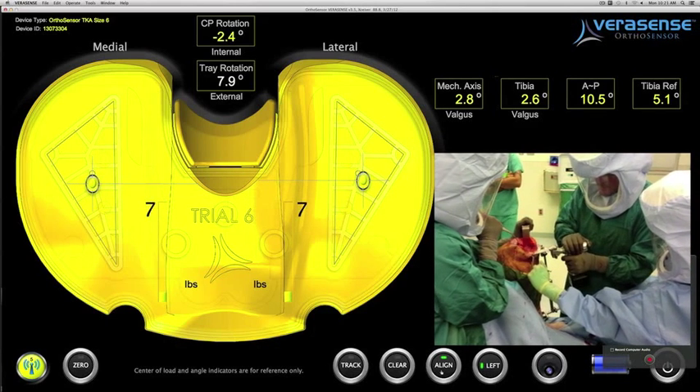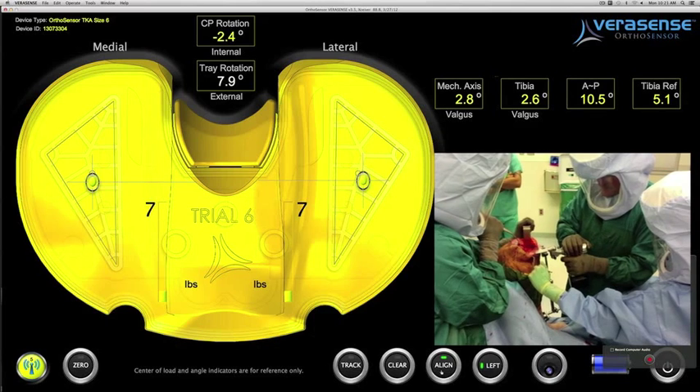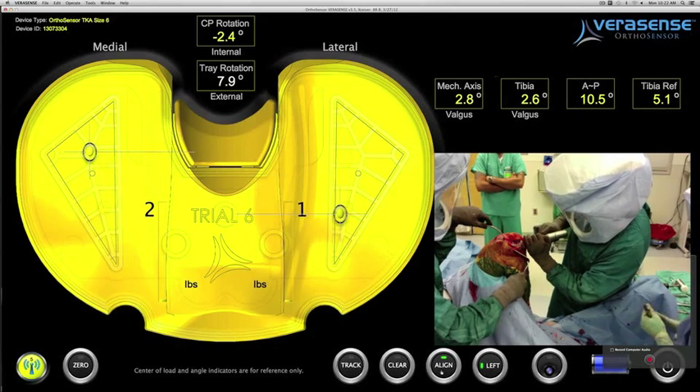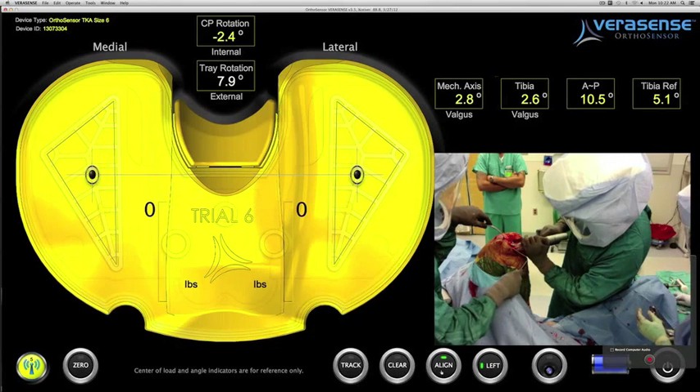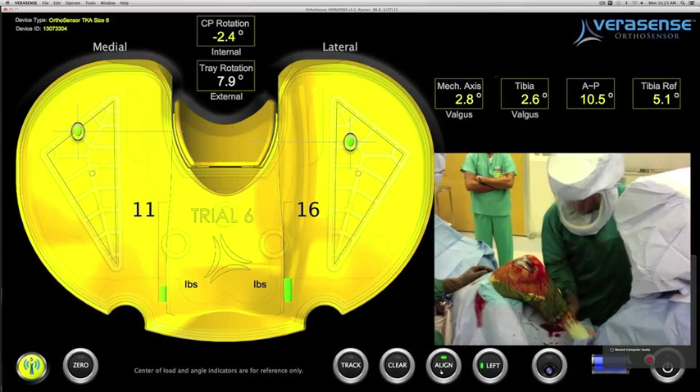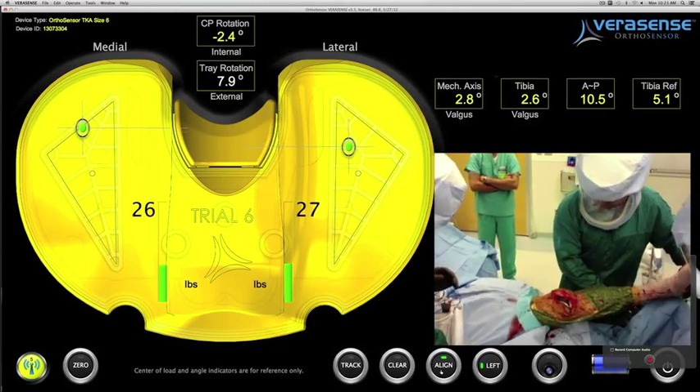After making the full resection and protecting the PCL ligament, the surgeon now retrials the implants. By resecting the posteromedial corner, the semimembranosus has been released as well.